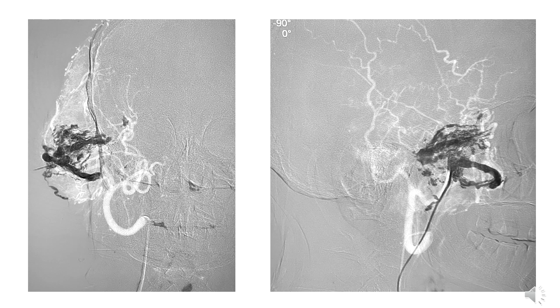We obviously use road mapping or smart mask techniques to overlay the vessels and the tumor. Here we can see on this anteroposterior and lateral frame, the glue is being injected, and white structures seen are the blood vessels and the tumor parenchymal vessels, which is basically the smart mask technique of the DSA image which we have used.